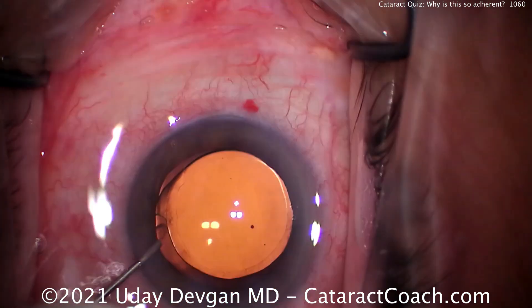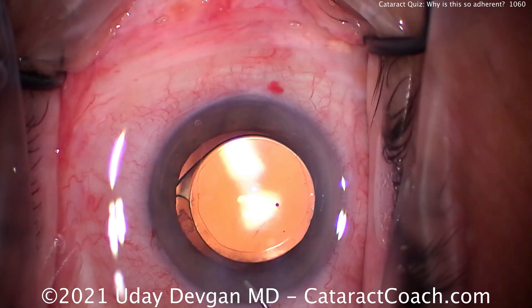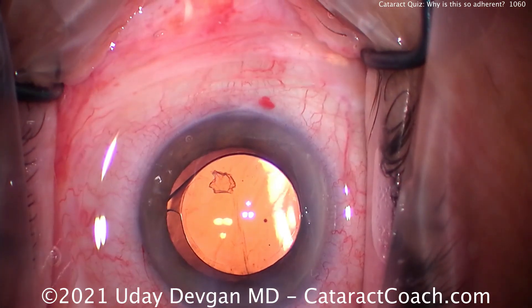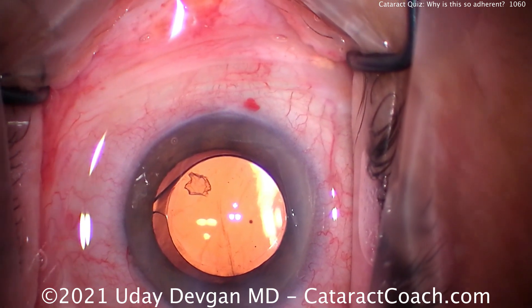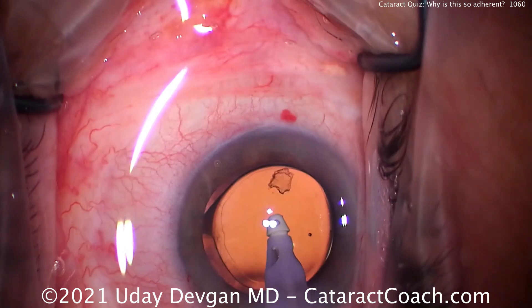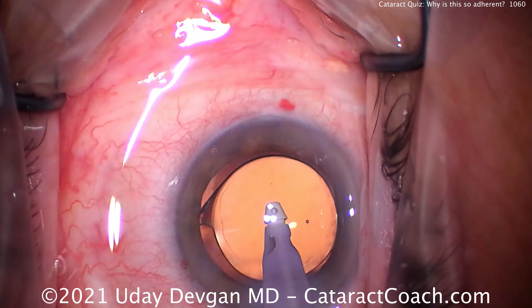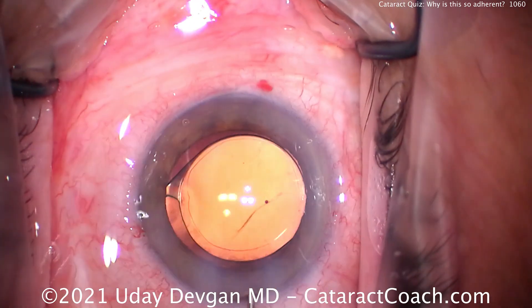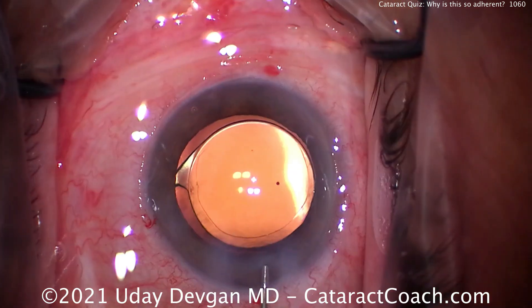The lens is in good position. A little bit more angle sweeping — there are really no issues now. We did inadvertently grab the capsule, and that was with the IA probe as we were trying to polish the undersurface of the capsular rim. So there's a balance — remember, first do no harm. If you're a novice surgeon or early in your career, you don't necessarily have to go and polish the undersurface of the capsular rim for every case.